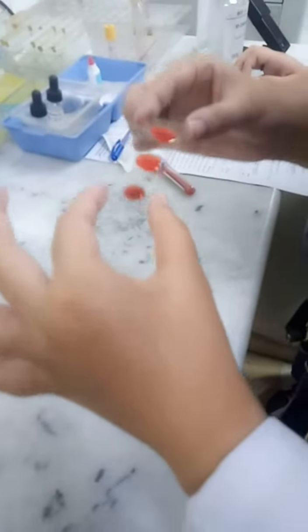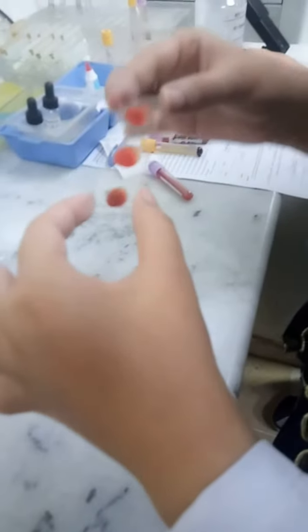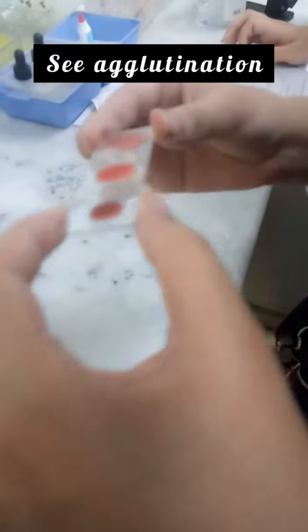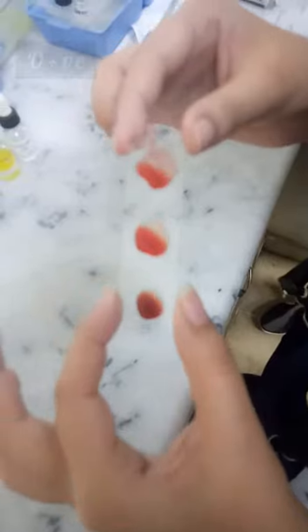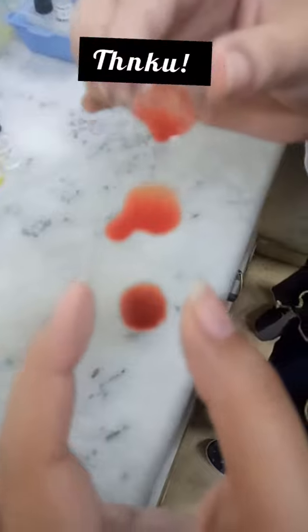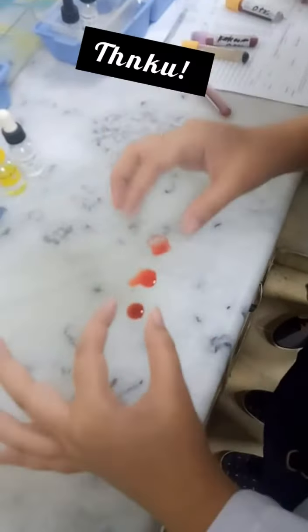Now you have to shake it in this way and start observing the clotting. If agglutination occurs — as you can see in the third one, we have agglutination — so it is O positive blood group. We are done with the blood grouping.